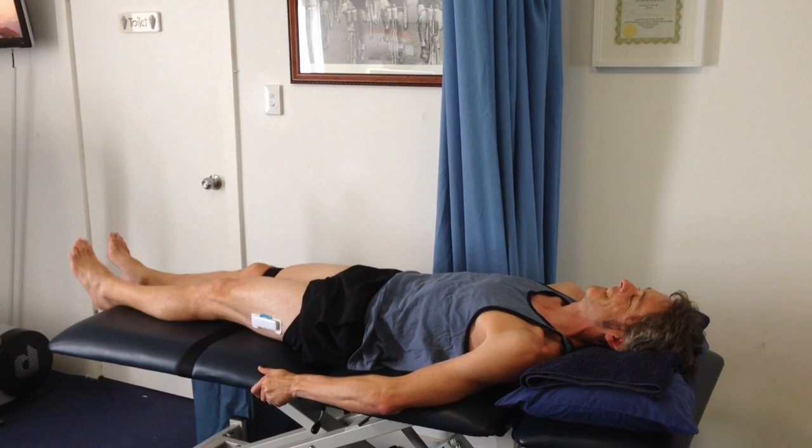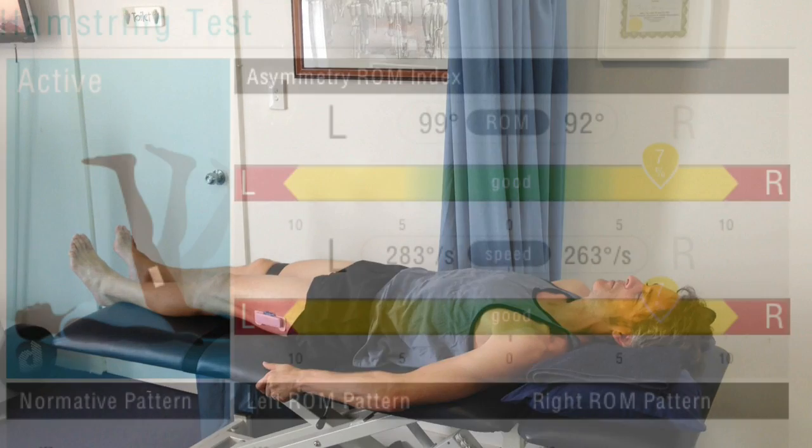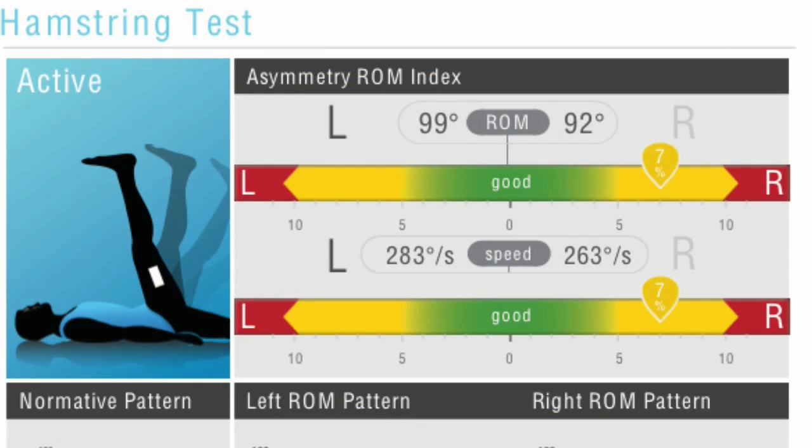All the time the ViMove is measuring how quickly this is done. Once we perform these tests on the other side we can see any asymmetry between the left and the right leg.